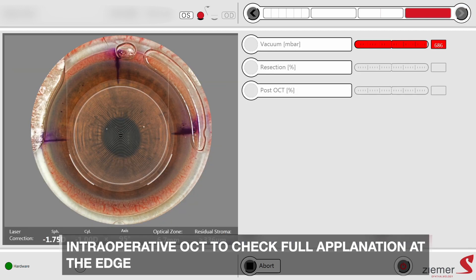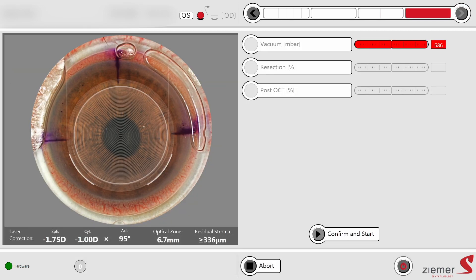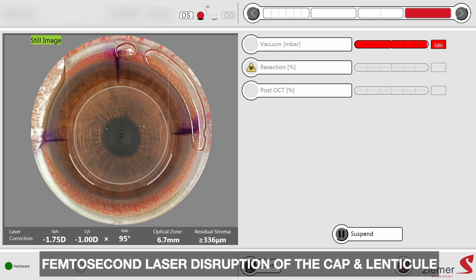The femtosecond laser disruption is initiated, with creation of the lenticule interface, then the cap interface.